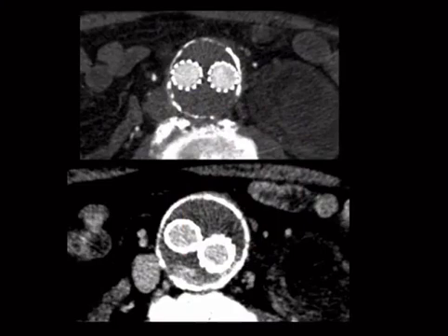So this is a stent graft study. If you've seen a stent graft study done, it's typically done with 3 phases. You've got a pre-contrast, then you have an arterial phase where you opacify the stent graft, and then you have a delay. And the reason you're doing that, well, there's 2 things you're looking for. One is the sac size, because sac size matters. You want to see if it's getting smaller, staying the same, or getting larger.